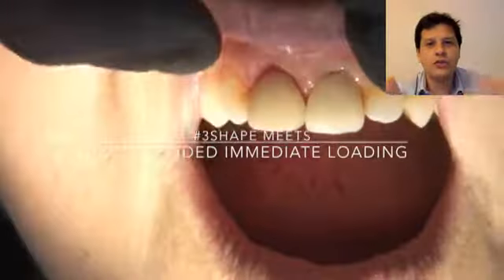So you have here two situations that you saw already. In one situation, the implant goes in, you do an impression, and you have a final work. The other is you plan your provisional restoration, so everything is ready to go. Of course, between one and the other, the second one has more potential errors because you still have to rely on the merging of your CBCT scans and your intraoral impression, which can be a problem.